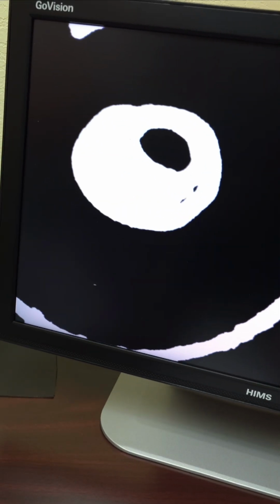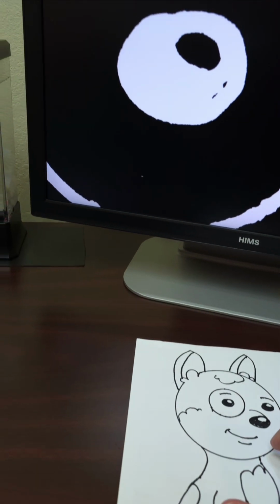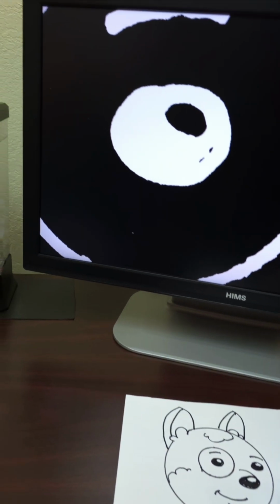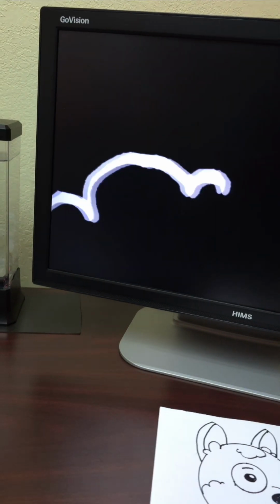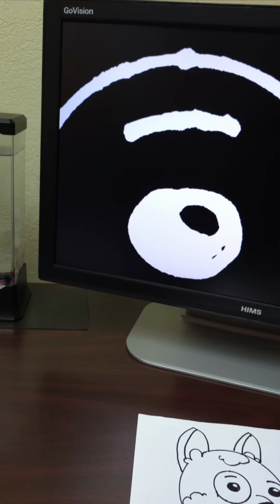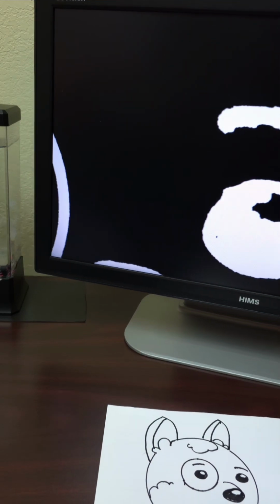I'm gonna move the paper. So when you're working with magnifiers, you want to keep your head steady, right? You want to look at the screen, and while you're looking at the screen, you move the paper underneath. You can move it left and right, down, up. It takes a little bit of getting used to. Some people might get like motion sick from watching it.